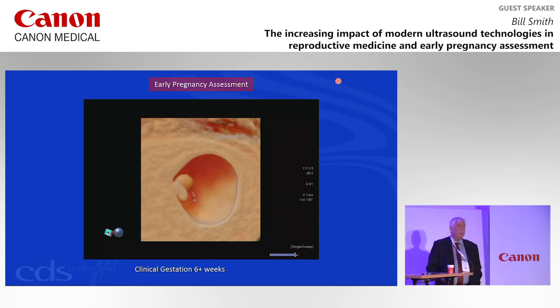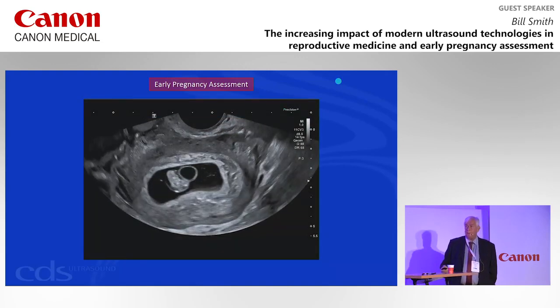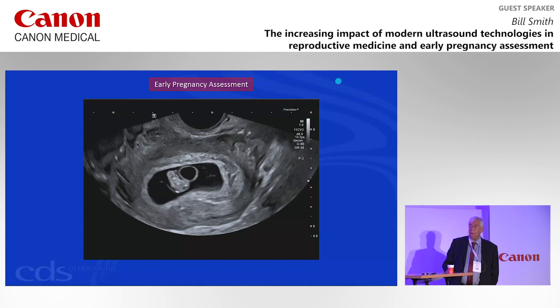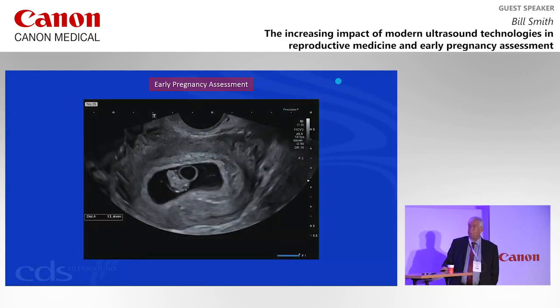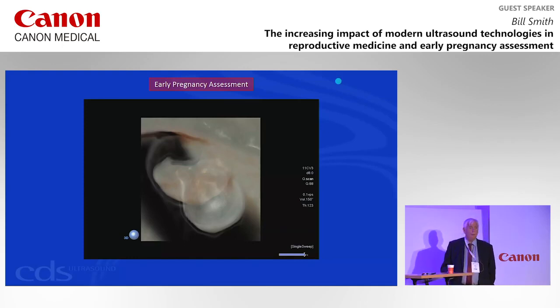And certainly if you're involved with infertility, recurrent miscarriage, you are doing a lot of early pregnancy scans. And if we take this case here, see it's a heartbeat there. There's the yolk sac. And this is 7 to 8 weeks. And the diameter of the yolk sac is virtually the same as the crown rump length. So we know that this is an abnormal pregnancy. And this was a trisomy 18 who miscarried. She miscarried at around 10, 11 weeks.